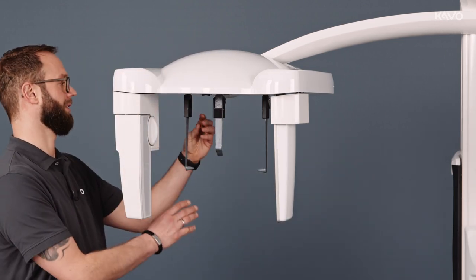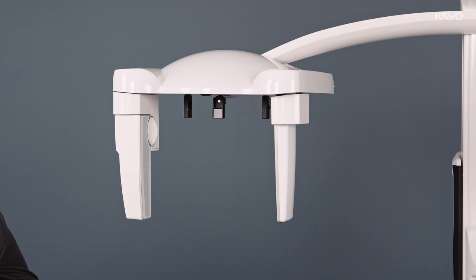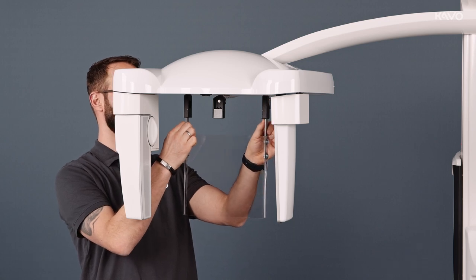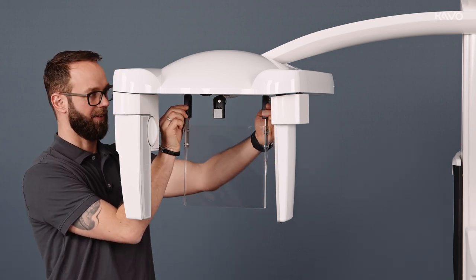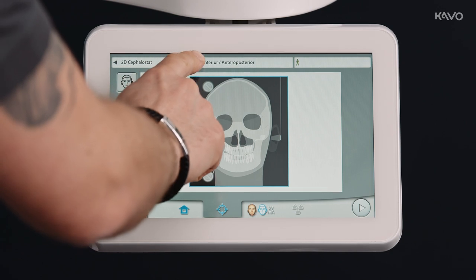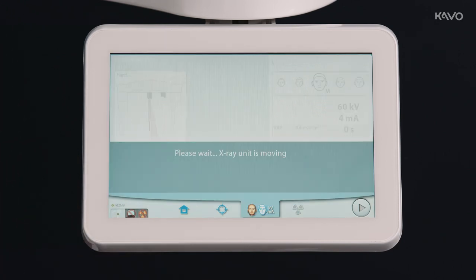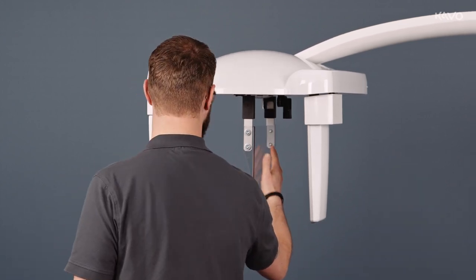To create a handheld image with the Ceph unit, we first disassemble the headrest and nasion, and attach the hand carpus plate. After that, we rotate the frame to the hand carpus position. We now select hand on the display and go to the positioning level. Now we can position the patient's hand on the hand carpus plate, go into image-ready mode, and perform the imaging.